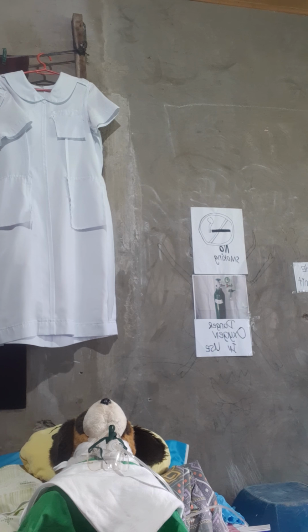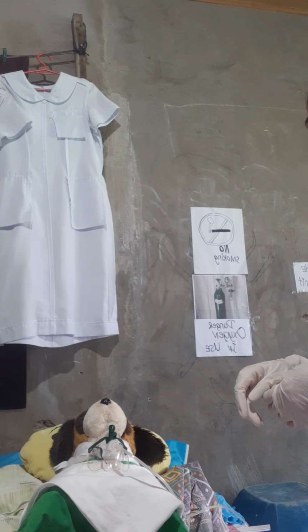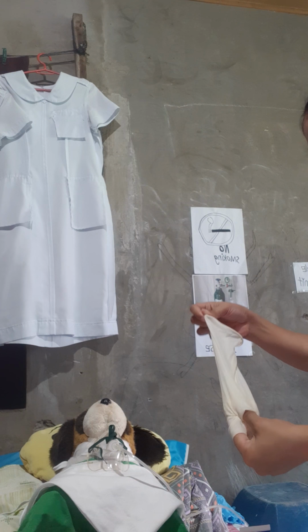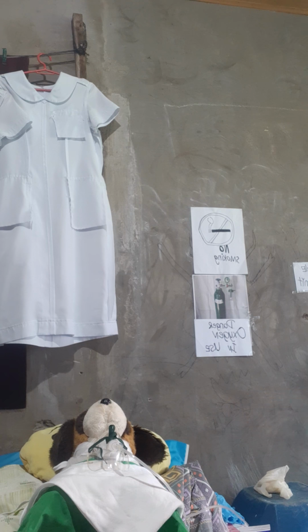Then remove the face shield, goggles and mask if used. Then remove the gloves and perform hand hygiene. And for evaluation, we are going to reassess the patient's respiratory status, including oxygen saturation, respiratory rate, and lung sounds.